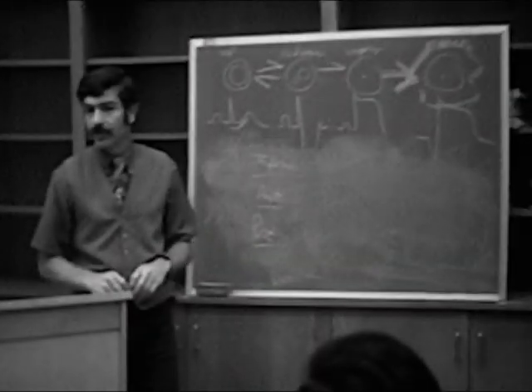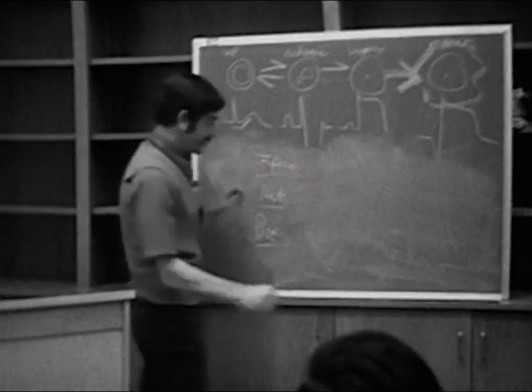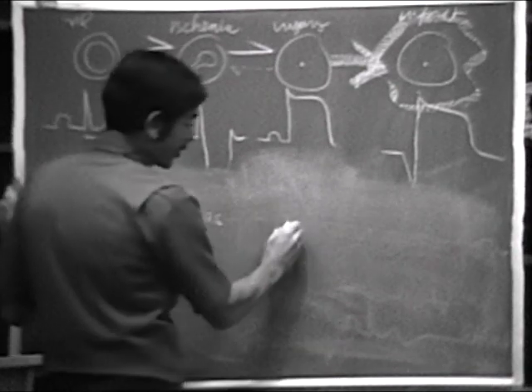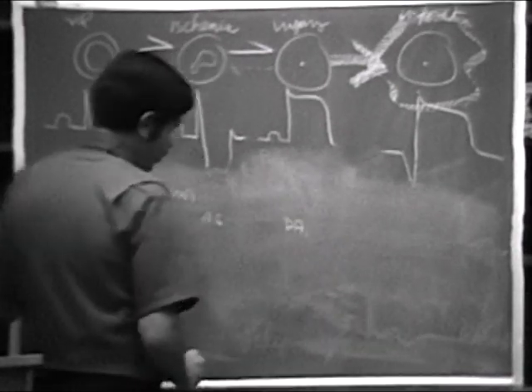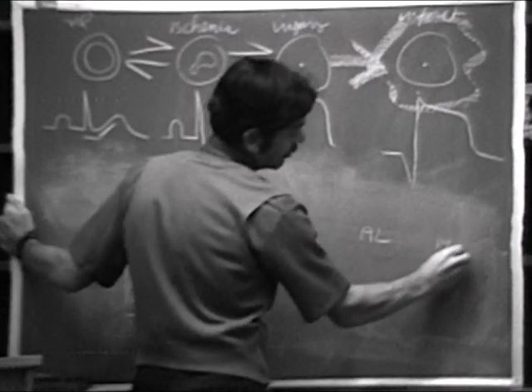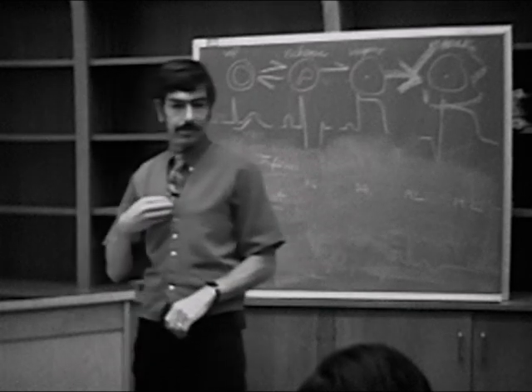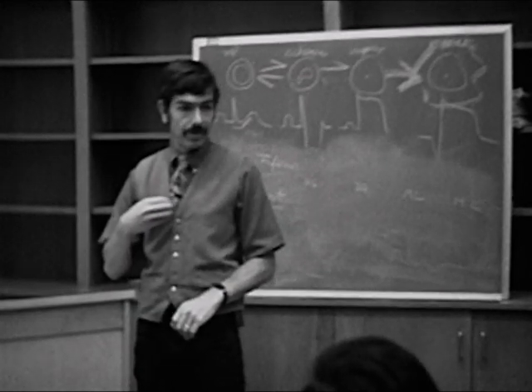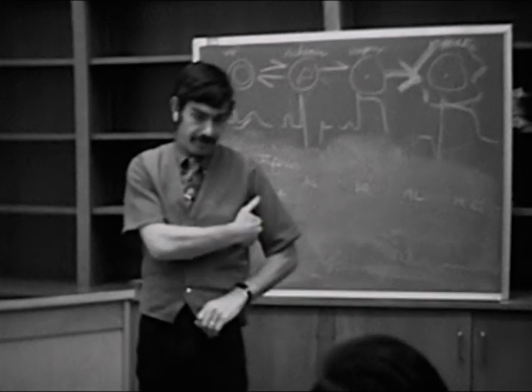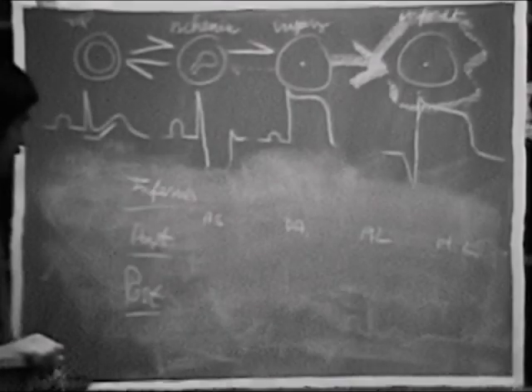But how would you like to divide the anterior wall if you had your choice? Yeah, all right. Well, we have anteroseptal, we have direct anterior, then we have anterolateral, and then finally we have what they call high lateral. Anteroseptal being located really in the front here over leads V1 through V3, and as you go around more towards V5, V6, right? And we'll go into that in a little more detail.